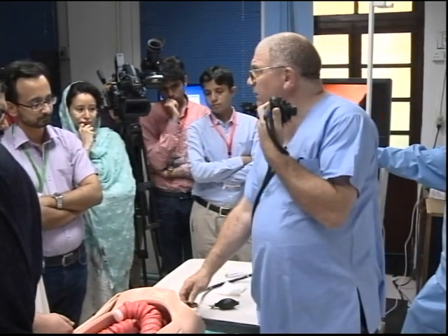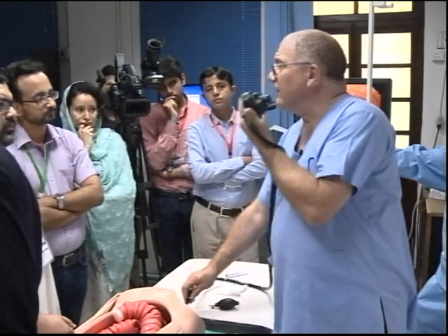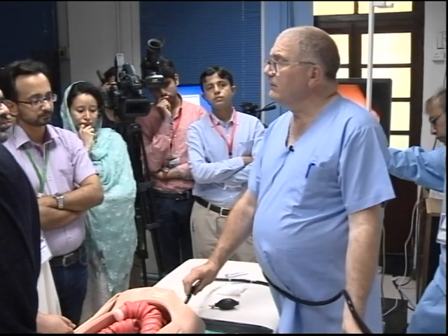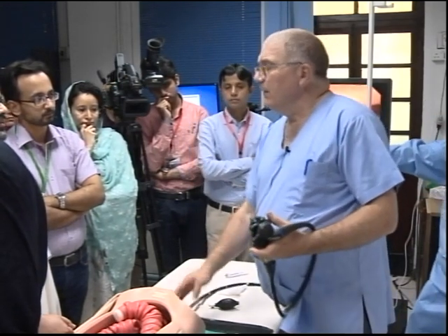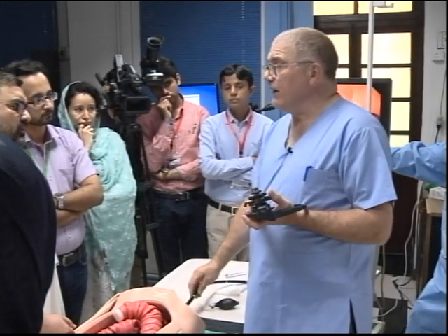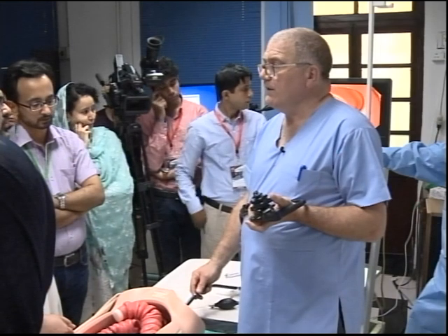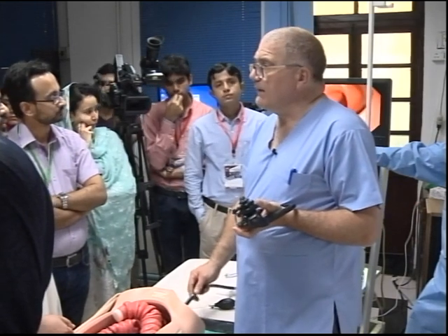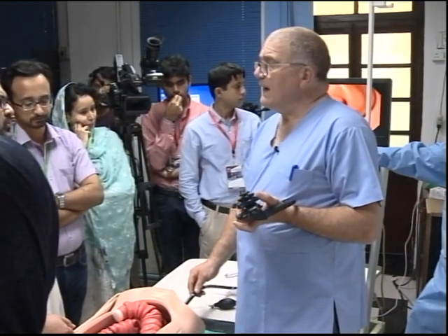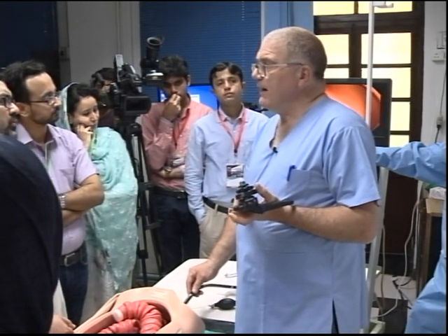Watch, I can rotate the scope because I use this. Actually, having a bit of grease on your hands, I'm not asking you to change. I want to demonstrate so that when you go along, you can actually do things. So here we are, coming to a part of the bowel. I like a bit of grease on the fingers. I'm going to do this on purpose. This is a part of the bowel.